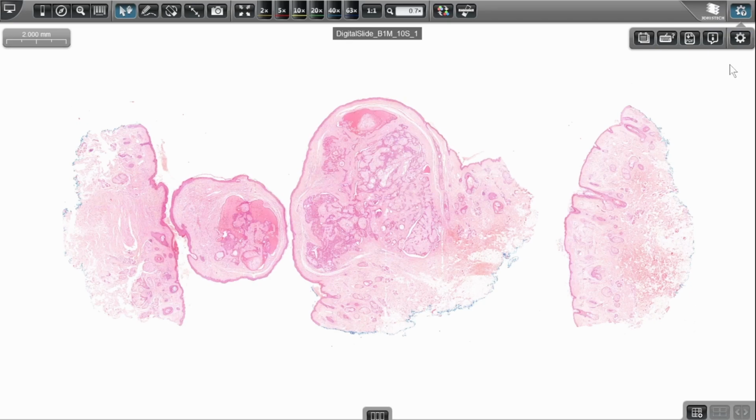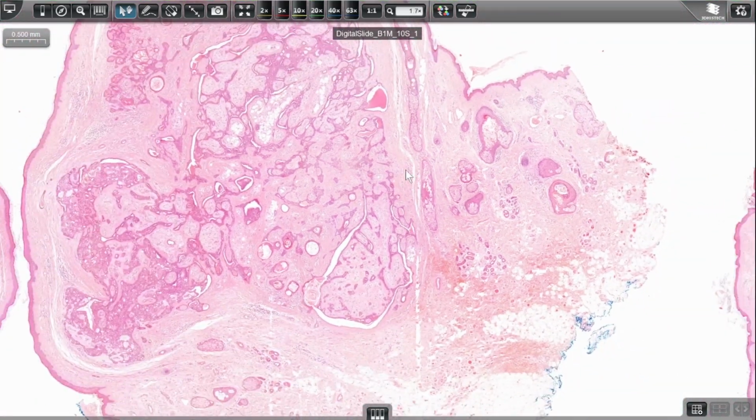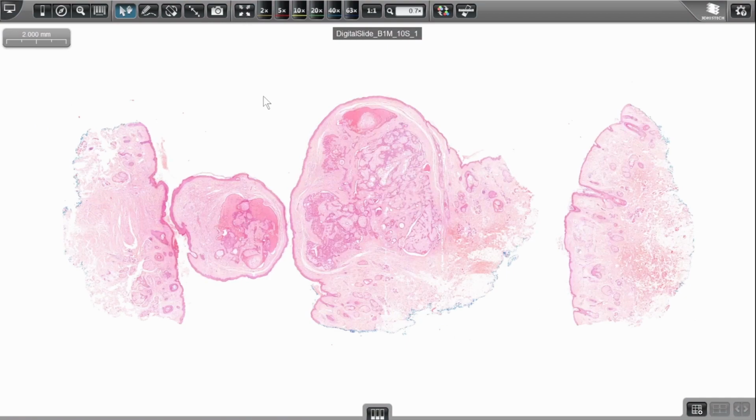Once you have got this general idea of how to do it, we need to look at the viewer and how we can make this connection happen. The viewer itself is almost completely configurable, and as you can see, the keyboard shortcuts achieve all of the functionality that you can achieve with an ordinary mouse scroll wheel, as well as the buttons on your keyboard.